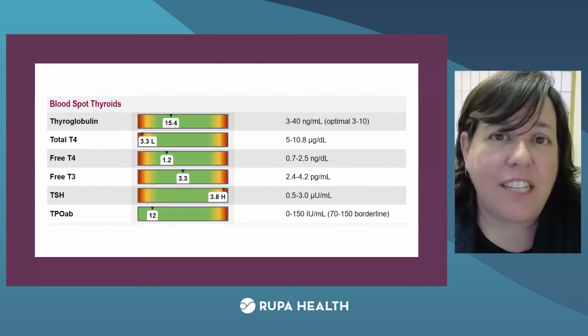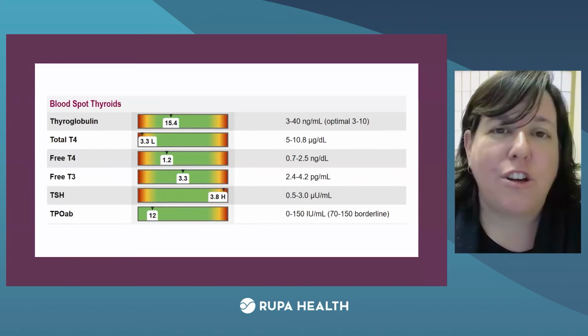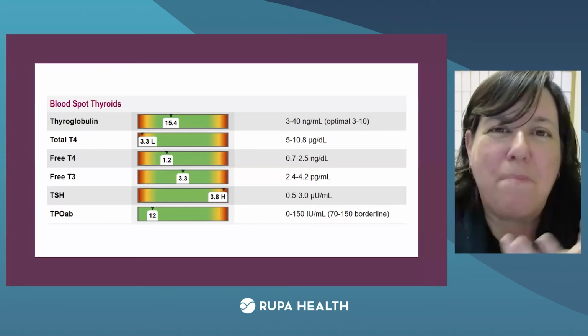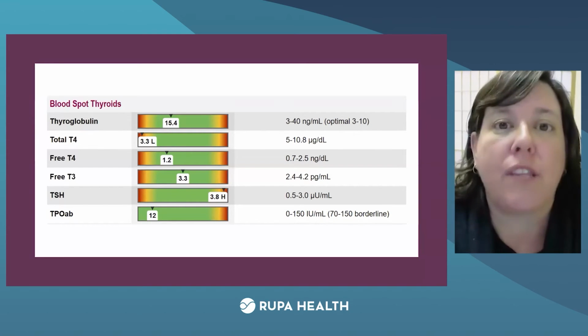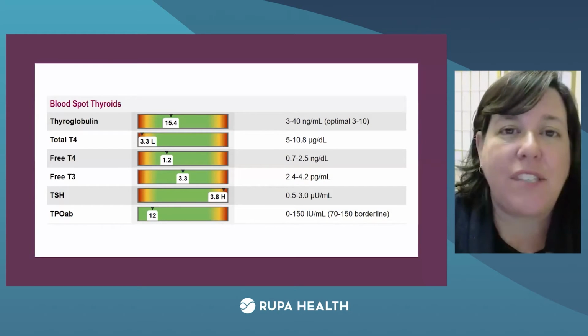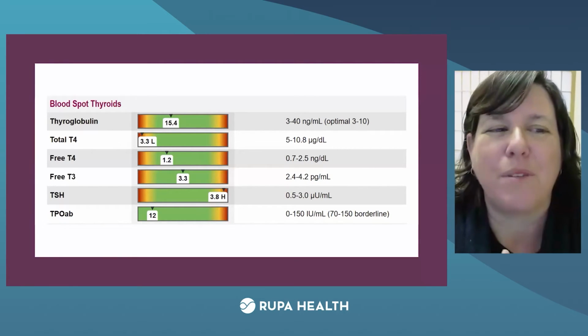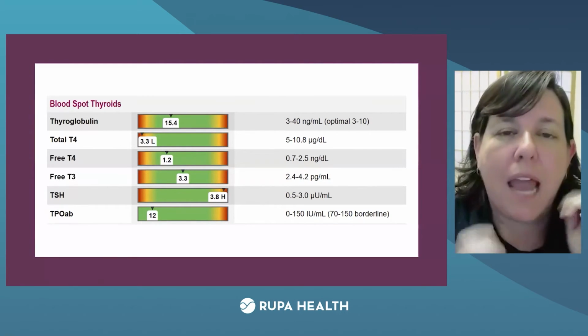And I think it's interesting that in this person, the total T4 actually showed the low, but they were changing how they bound that, right? To make sure that they keep that T4 normal as long as possible. I have seen people with normal T4s and T3s where their TSHs were 12. I didn't manage to find one of them to pull for this presentation, but I have seen that.